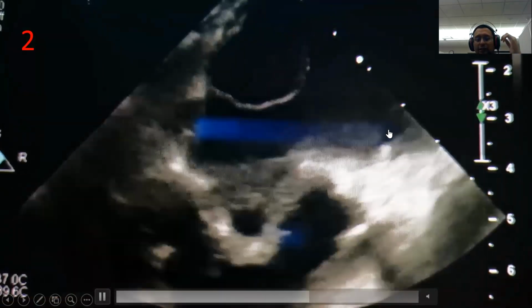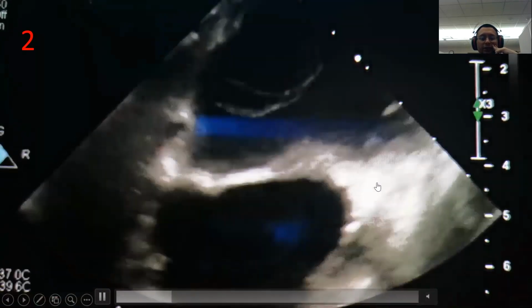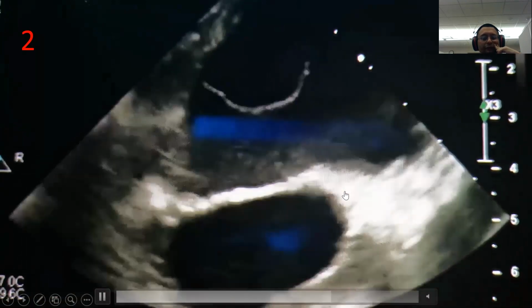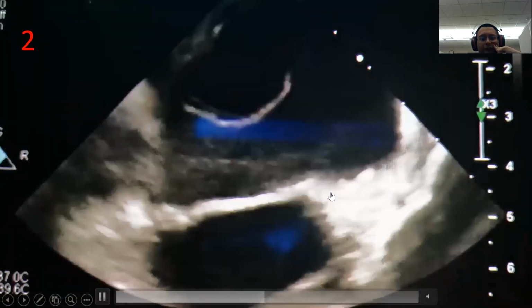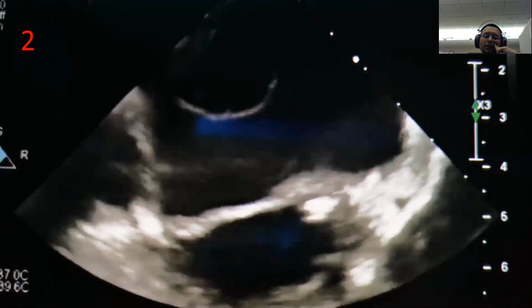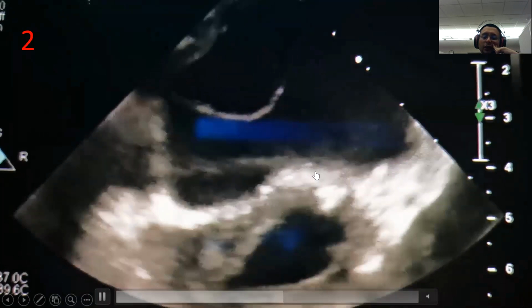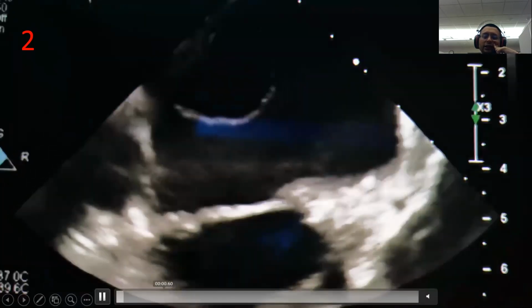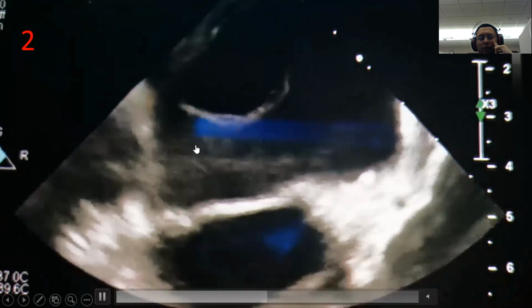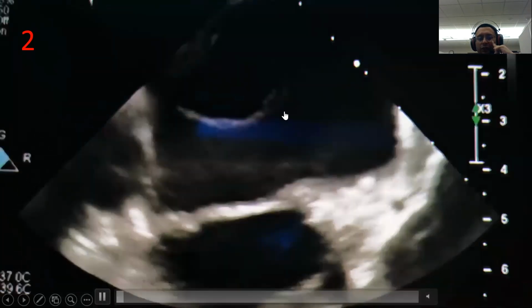What about now? This is a left atrium, left ventricle. Now you see this image. What is your analysis? Do you want to change from myxoma to something else, or do you want to continue with myxoma, Ceiling? Not sure. What about you, Sarah? Not sure. So I just wanted to tell you, whenever you see a cyst like this, the differential diagnosis, of course, includes a cystic structure such as interatrial septal aneurysm, or even sometimes after an ablation procedure, you can actually inject into the wall of the left atrium and cause dissection of the left atrium. So that is also possible.